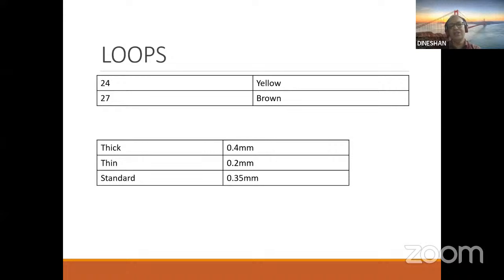Thin loops are always preferred when you need a sharp, precise cut, usually in bladder resections, tumor resections, and especially near the apex. If you want to resect near the apex of the prostate also, a thin loop is always preferred. Thick loops are preferred when you want to resect a large adenoma. But these are all theoretical, but you must know all these things.